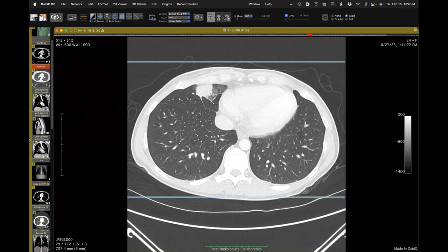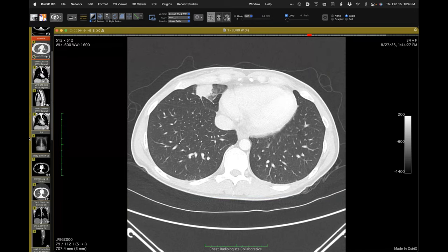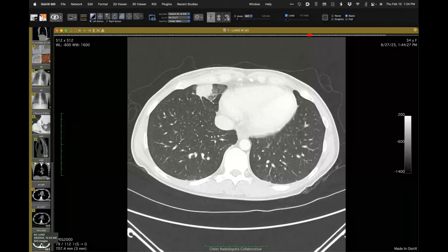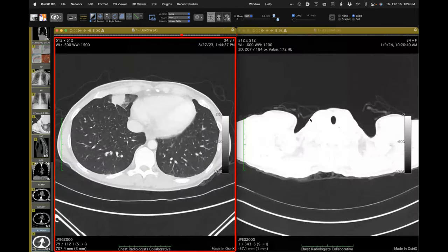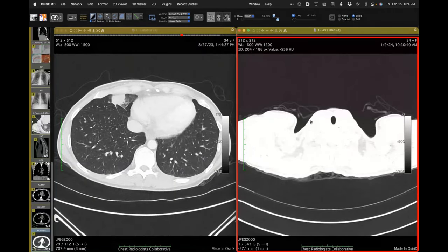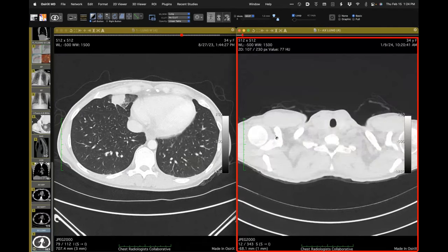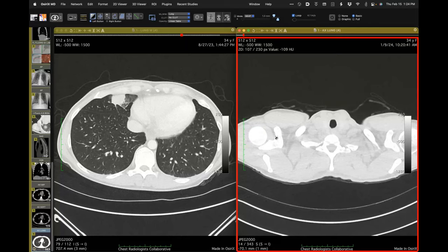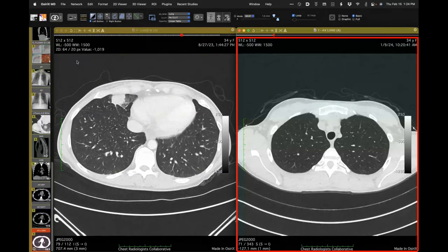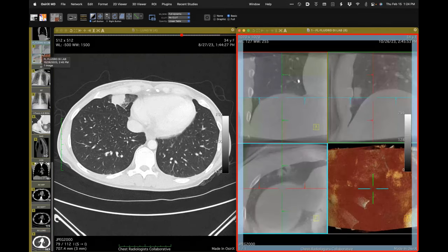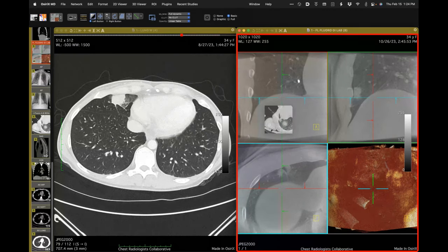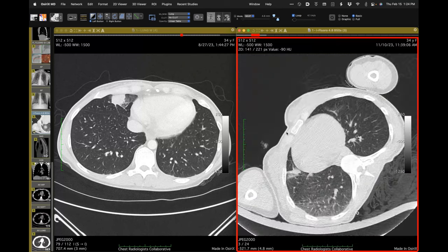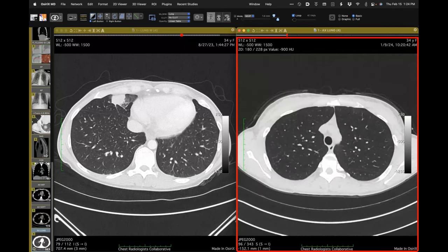I looked through the whole series — the surgical lung biopsy was done in January, and this CT is two days before the biopsy. In the interim, they tried to make a diagnosis by navigation bronchoscopy using the Ion device — that didn't yield a diagnosis. A CT-guided biopsy in November also did not reveal a diagnosis. So they proceeded to surgical lung biopsy.